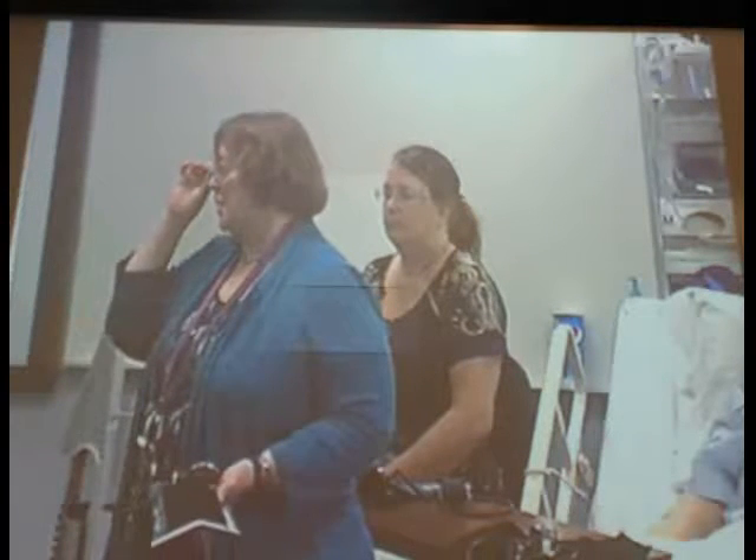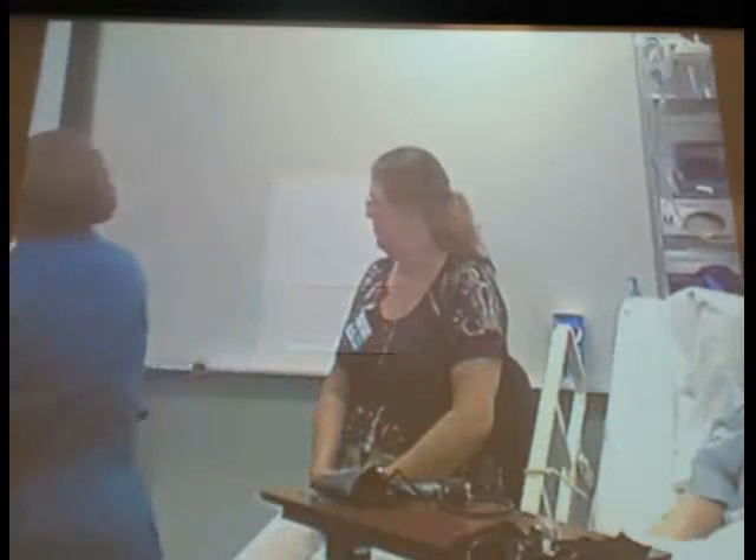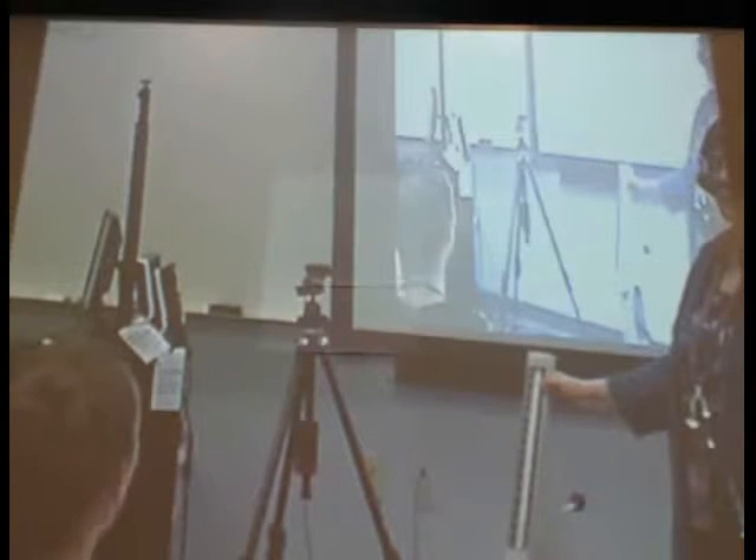We're going to talk about blood pressures. We talked about in class that the mmHg — millimeters of mercury — would be for something like this nice old device, which truly is a mercury reading sphygmomanometer. But you don't see these very much anymore, so the mmHg is usually dropped when we're reporting blood pressure because these don't work like that anymore.